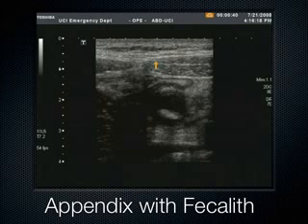There are risks that you can do to patients with ultrasound, such as dislodging a DVT. That does frighten me, but compressing an appendix, I don't think there's enough extrinsic pressure that you could perforate it. I think really the true perforation comes from the inside getting ready to make it pop. Because, yeah, we're pushing a lot of pressure, and maybe I oversold that too much. We're not pushing so hard that we're causing a very local part of it to perforate. I mean, we're pushing enough just to kind of get the muscle bellies to come together.